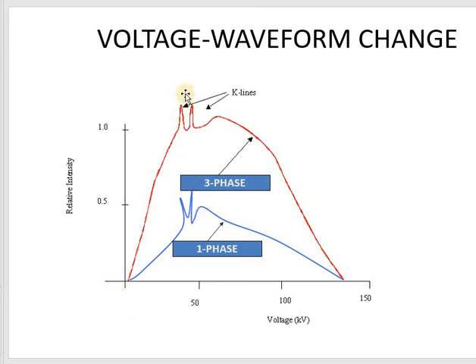So these two spectra look similar, with the intensity peak at almost 50 and slightly higher, 60, for three-phase power supply, but the characteristic peak remains the same, because that's only unique to the anode target, and has nothing to do with single-phase or three-phase power supply.